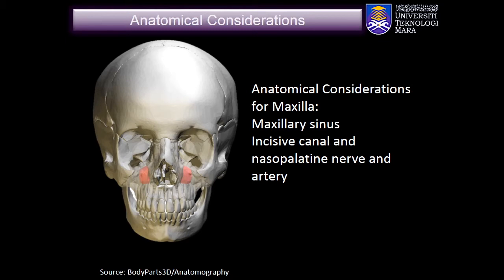Depending on the location of the missing tooth, the implant placement site may be in close proximity to vital structures, such as a nerve or blood vessels. Encroaching on these structures may result in perioperative and postoperative complications, such as bleeding and paresthesia. In the posterior maxilla following tooth loss, the maxillary sinuses may be pneumatized, and if bone height is not sufficient for a short implant, sinus lift procedures have to be considered.